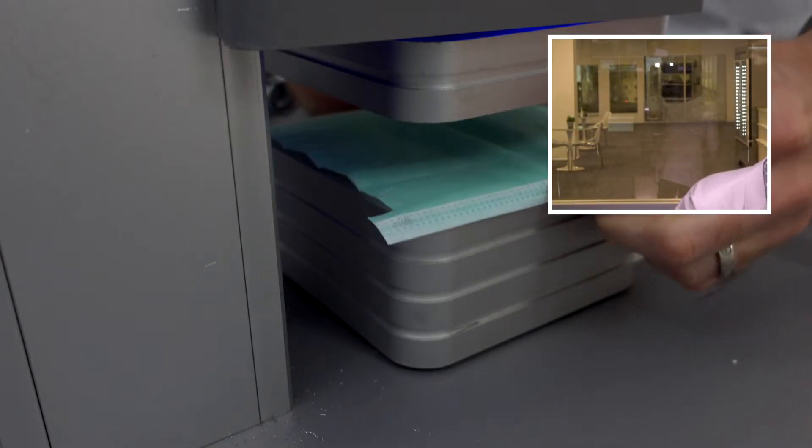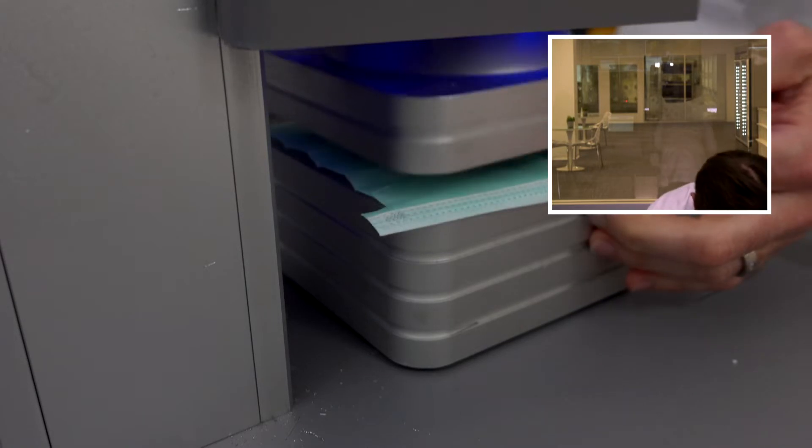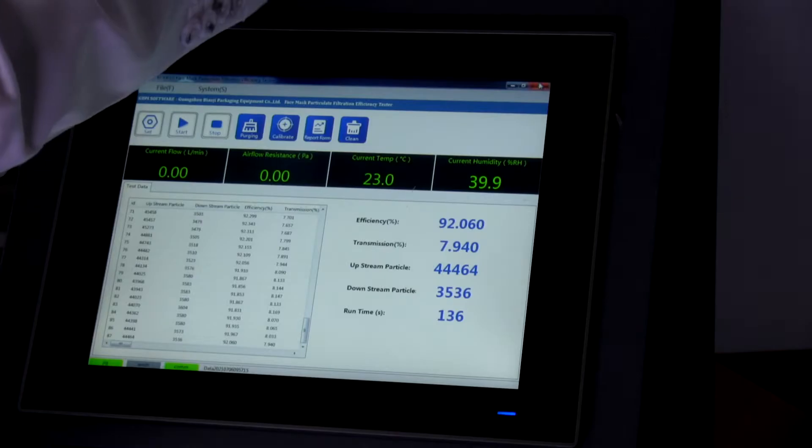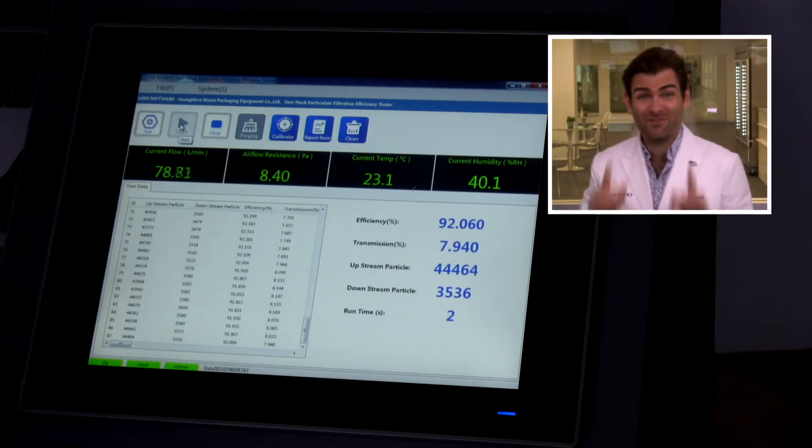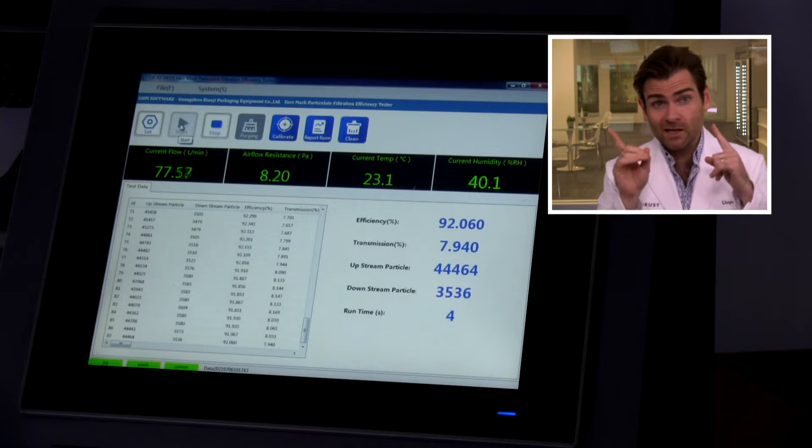It's a nice color. This is a PFE machine — Particulate Filtration Efficiency machine. If you want to find out more, check out that link. Note: we are testing just the fabric today, not the fit. Both things are important — fit and filtration — so keep that in mind.